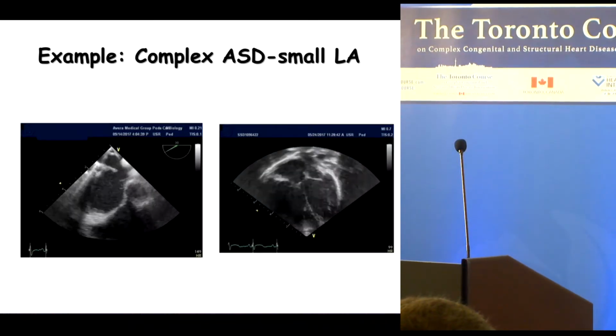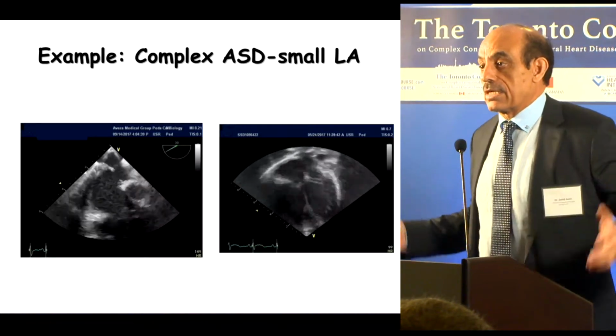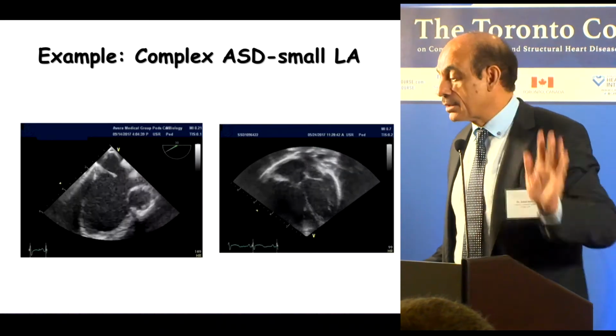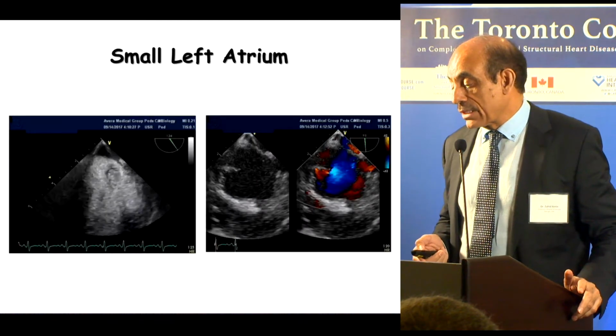Not this. Defect is higher. So LA is almost as big as the disc will be, or the ASD will be. You're never going to be able to put the device or the disc parallel in this situation. Even if you think you are able, you can do it.